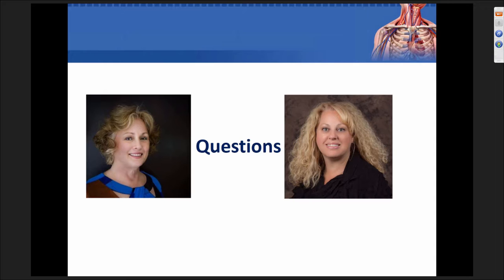Education, and evidence, and structure, guideline, and remember that every discipline, regardless of who you are in the hospital, practices to the policy and the standard. So the first thing I would do is get the policy. What does the policy say? Make sure everybody is well educated about it. Don't leave anybody out when you're doing education and training. I have a lot of dynamic respiratory teams, and I have a lot of dynamic nursing teams, and the one thing that neither of those teams get enough of is education and collaboration. So ultrasound is changing the forefront of A-line insertion, and the requirement for the hat, mask, small sterile drape, and probe cover should be utilized and monitored with a checklist, just like for CVC insertion. So I hope that helps.